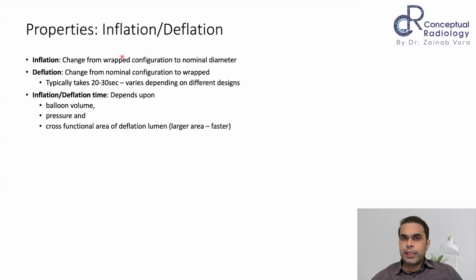Finally, inflation and deflation. When you inflate the balloon, it will go to its nominal diameter, and then once you've done the job, you will deflate the balloon and it will reduce in size. So that should be quick, and you should be able to restore and stop flow as good as possible. Of course, the time it will take to inflate or deflate will depend on the balloon volume.